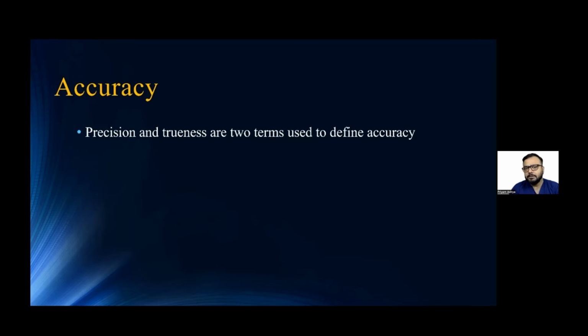Speed is also one thing which people want to look at, and they do compare a lot on speed. In fact, there's a lot of buzz around speed. But speed is something that will make you go faster and will definitely help in better scans, I believe. But I believe these points are more important than just the speed of the scanner.